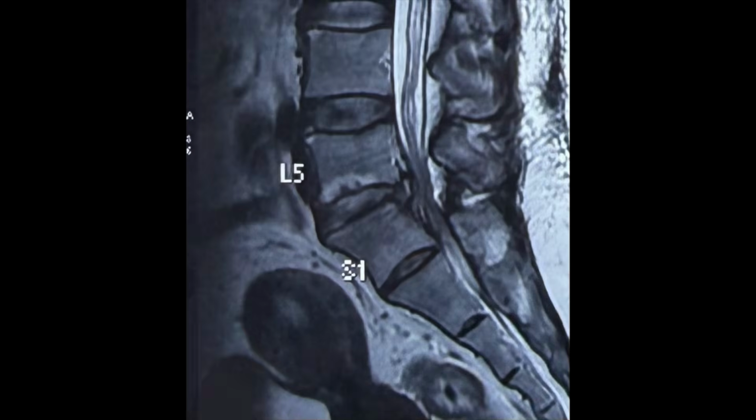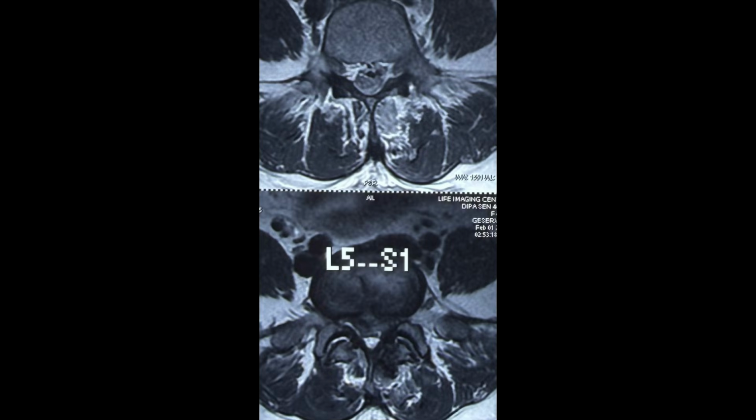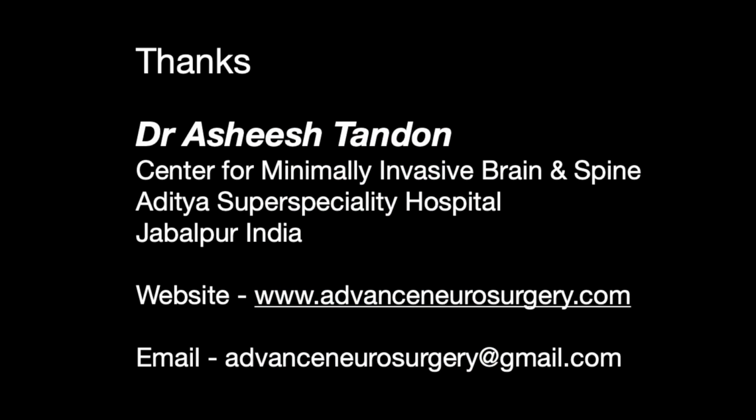The patient did extremely well. Her pain has resolved. There is perineal numbness. You can see the post-op images, which show a radical excision of these fragments.